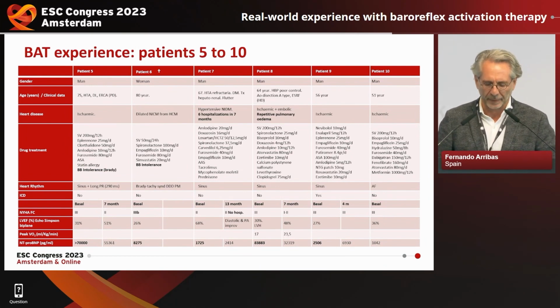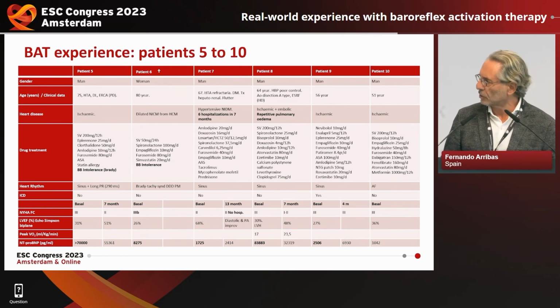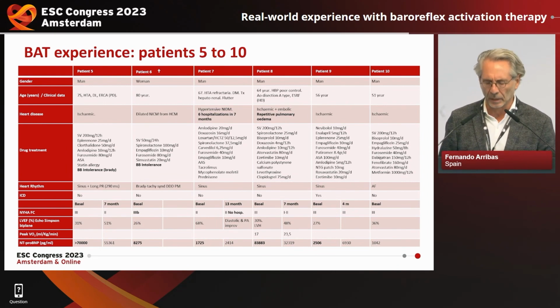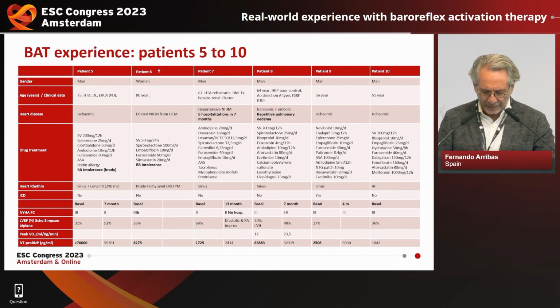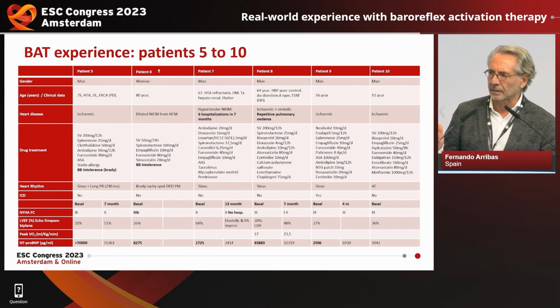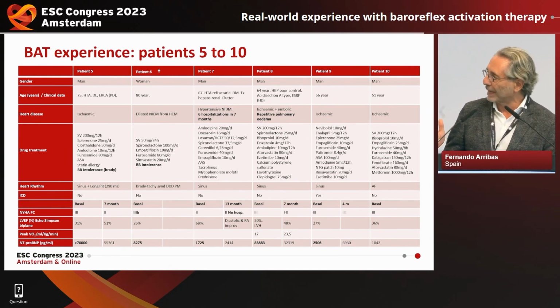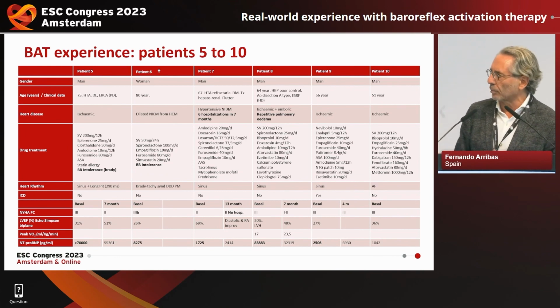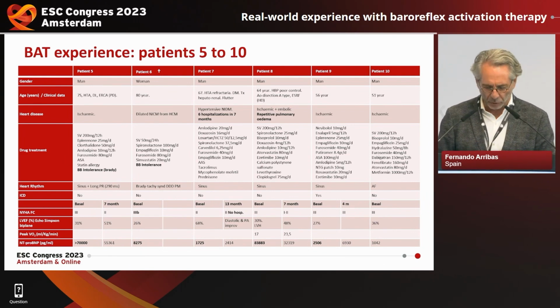These are the second 6 patients. You can see with me that they all are fully optimized, lots of medications, and despite that, the patients claim for something better. Bolded, you can see the significantly high numbers in the NT-proBNP levels. But you can see that despite these very high levels of NT-proBNP, the effect on the functional class, the quality of life, and even the NT-proBNP and left ventricular ejection fraction was not different at all as compared with the patients below 1600.